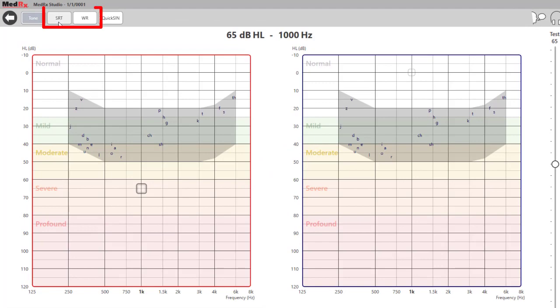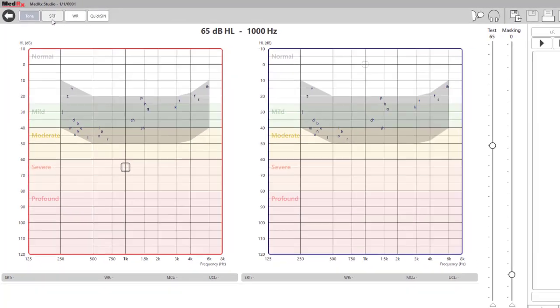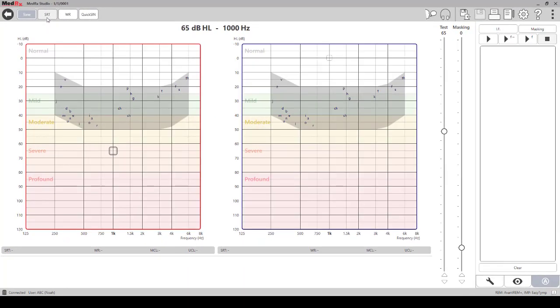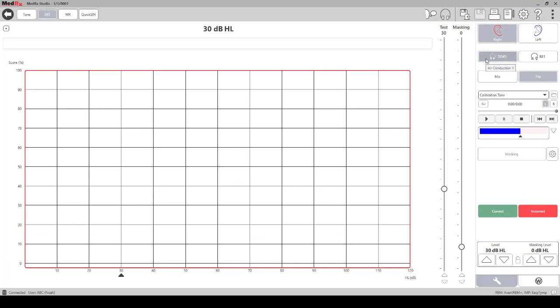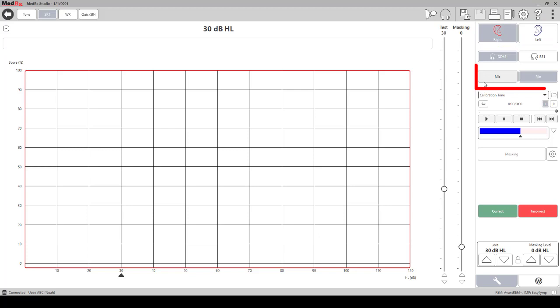SRT and WR. In the audiometry panel, the options are generally the same for SRT and WordRec. Speech testing options will include right and left ear, transducer options, speech input options, which include mic for live voice testing and file for recorded speech options.